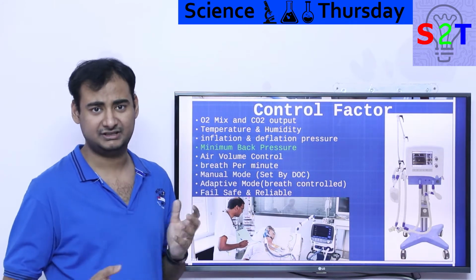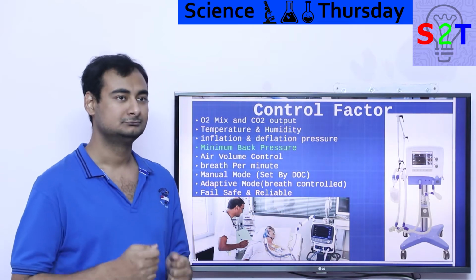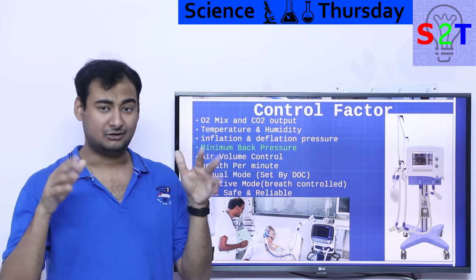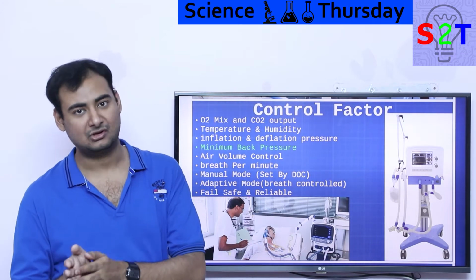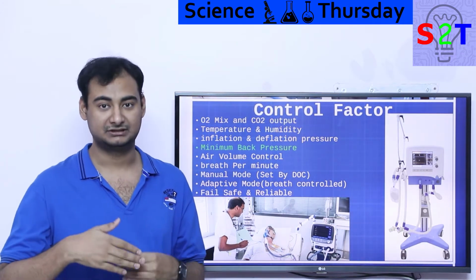Breaths per minute. Now this is very easy, but here's the deal: humans do not breathe in a continuous manner. It's not like we have exactly 15 breaths per minute. Mathematically it sounds good, but normally you are breathing, and then you take some deep breaths, and sometimes you take some short breaths. This natural rhythm is necessary for survival. It's not something that you can postpone.